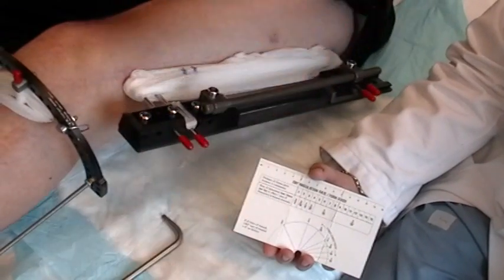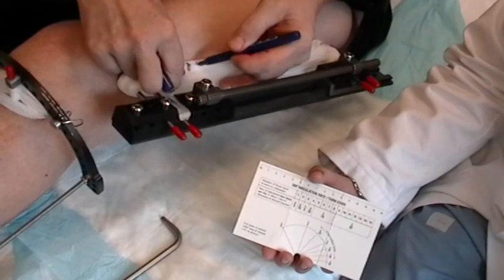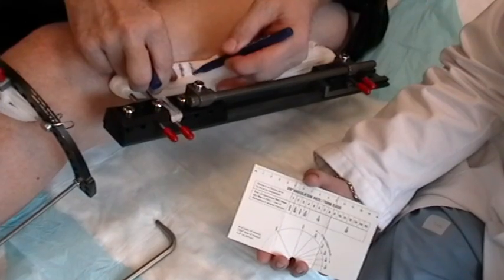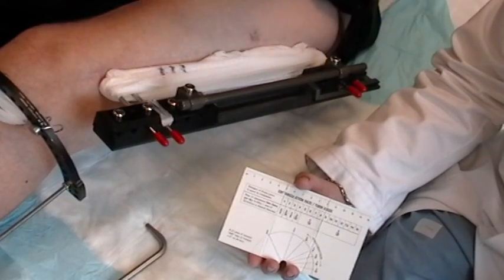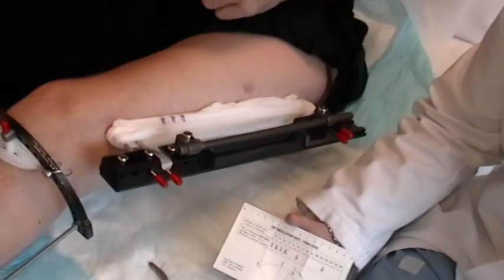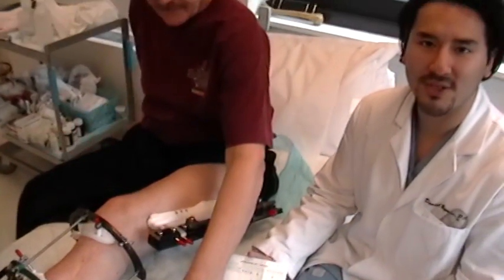Then, not to forget, I mark each time I do it on the bandage. I've done three today so far. As a note, nothing is set in stone — there are other ways to document how many times you've done it. There's no real way to definitively document, but as long as you do all the turns recommended, that's most important.